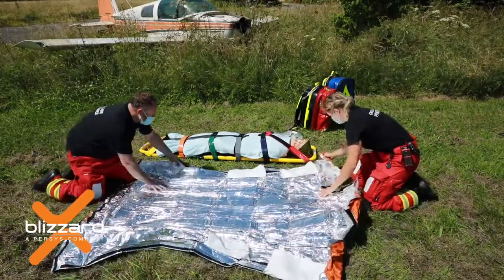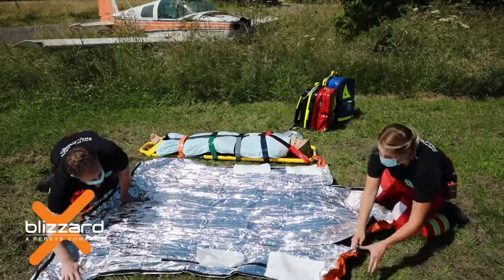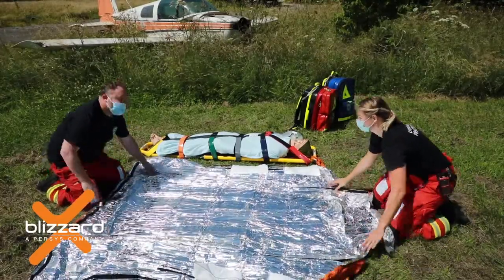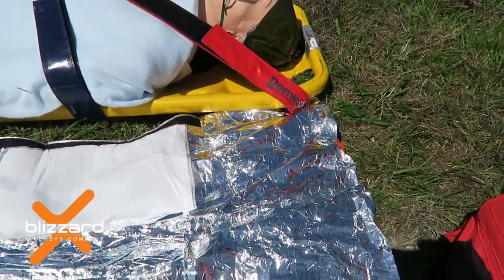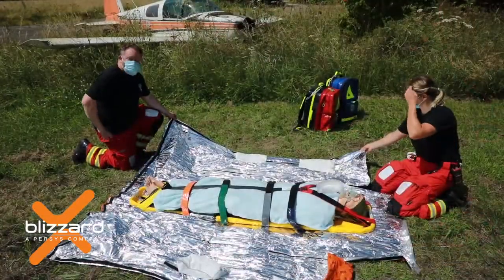Stretch the back panel material sideways before the casualty is placed in the product, ensuring the heat pads on the side panels are away from where the casualty's back will be placed. To ensure correct orientation, the head end is indicated by the single layer shoulder flaps and upper silver part of the back panel area.